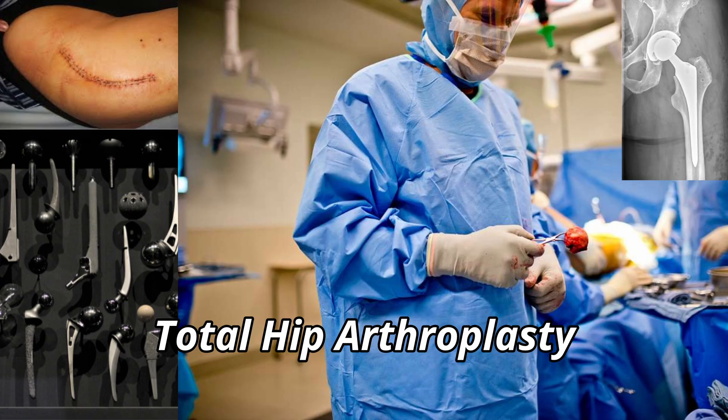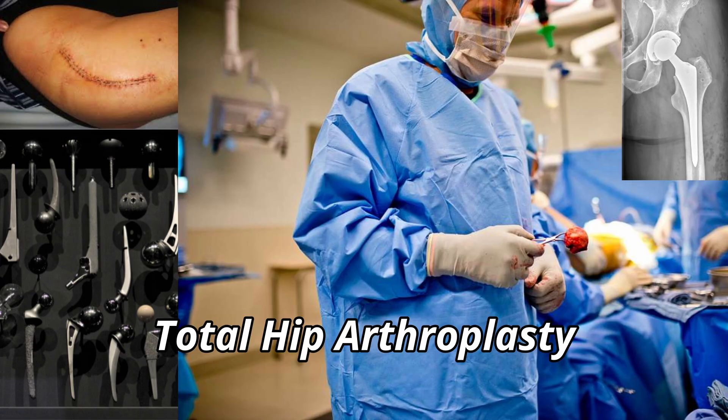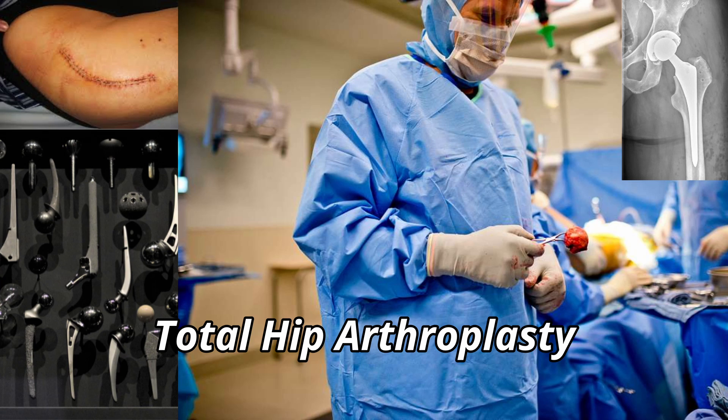Step 1: Indications and Patient Positioning. Common indications for THA include end-stage osteoarthritis, avascular necrosis, rheumatoid arthritis, and certain femoral neck fractures. Patients typically present with debilitating hip pain and reduced mobility that has failed conservative treatment. Under general anesthesia, the patient is positioned lateral decubitus with the operative side facing up. A beanbag or pegboard is used to stabilize the trunk and pelvis. The hip and knee are flexed to 90 degrees, padded and prepped in sterile fashion.